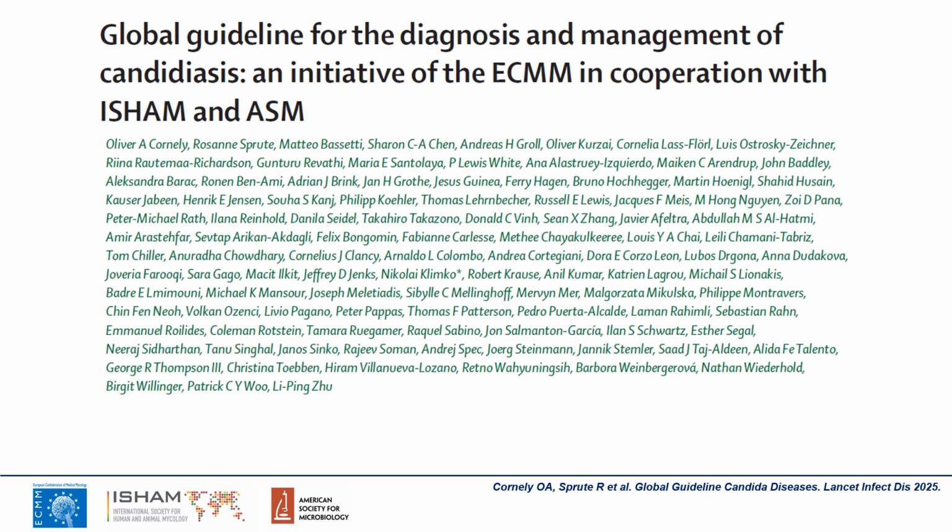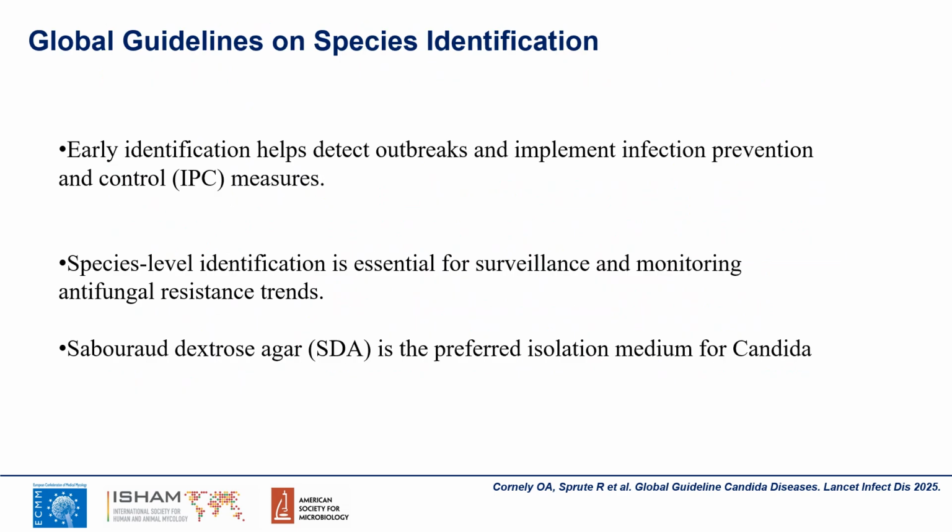We have multiple small videos discussing all the essential aspects of this guideline, and today my job is to discuss the species identification of the Candida species as recommended in these guidelines.